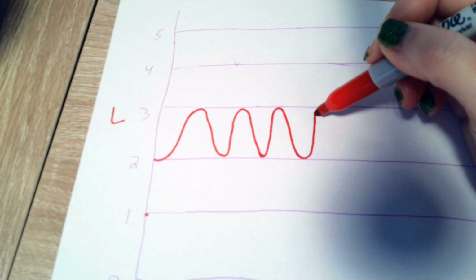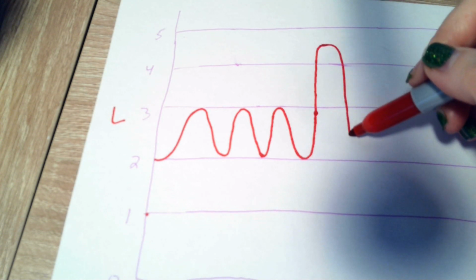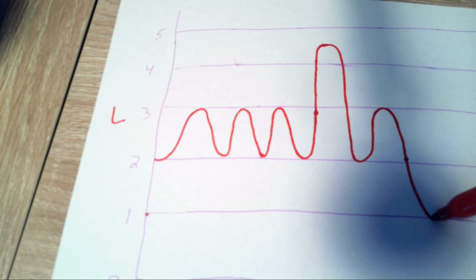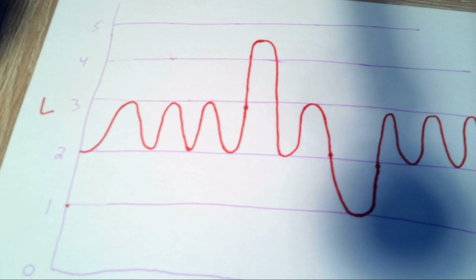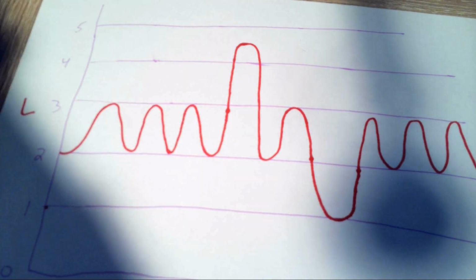Now we're going to breathe in, and we're going to take a big old inhale up. And then we'll come back down. We're exhaling. Let's have one more normal breath. We'll exhale normally, and then we're going to push some more out. So we're exhaling as deep as we can. And then we'll come back to our normal in and out. Okay, so we can't see all that over there. There it is. Okay, so all those volumes we can get from this graph here.